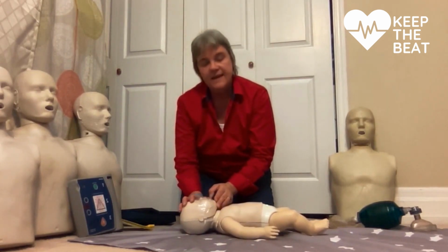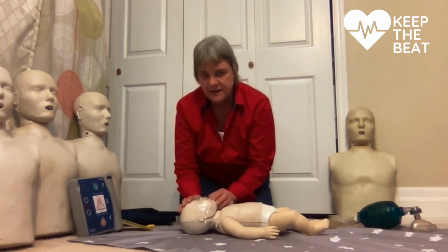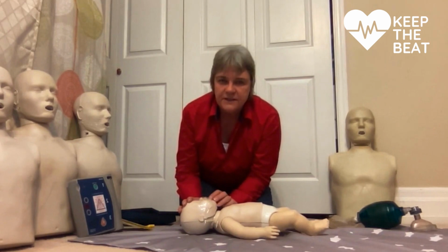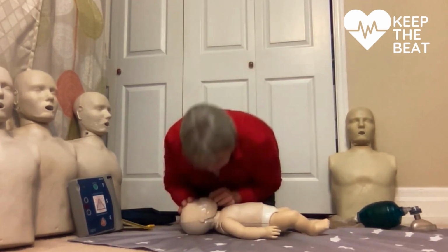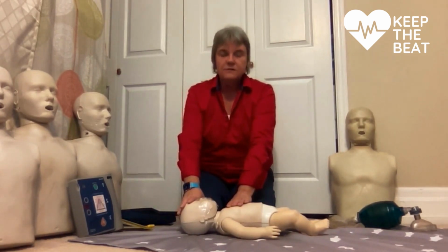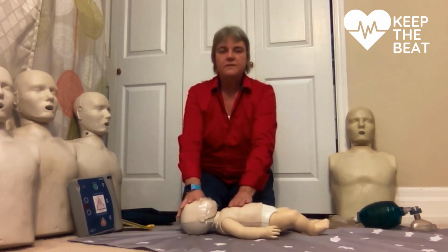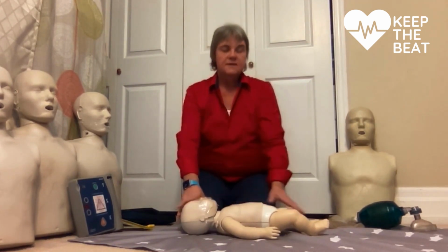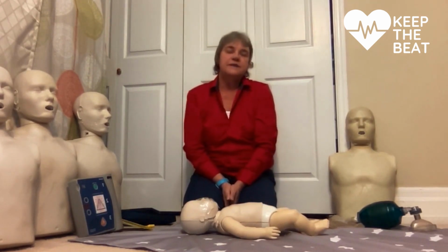I want to put the head into a sniffing position with this infant, not to occlude his airway, and I give very small puffs of air, just enough to watch that chest rise. Remember, their lungs are much smaller than ours. I was taught many, many years ago to fill my cheeks with air and then deliver each breath that way. I will continue this 30 to 2 for 5 cycles, and I'll reassess.